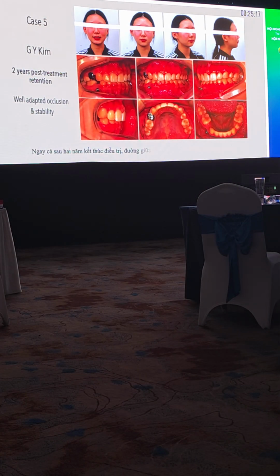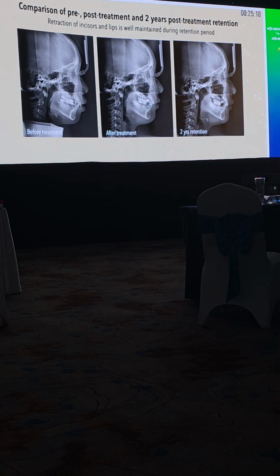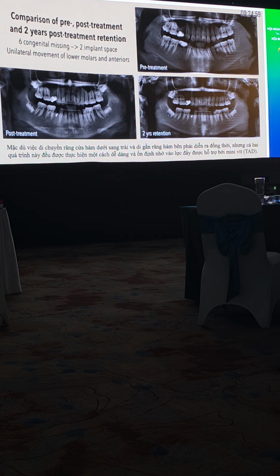Even at 2 years post-treatment, the midline and occlusion were well preserved. Throughout our 2-year retention period, the improvement of the incisors and lips has been consistent and well maintained. Although the leftward movement of the mandibular incisors and forward advancement of the right molars occurred simultaneously, they were achieved with ease and stably through the utilization of TAD-supported pushing force.